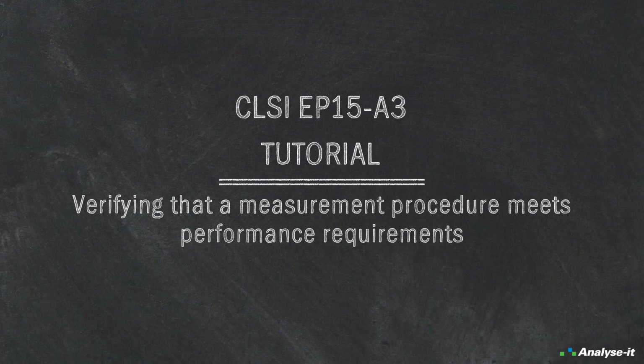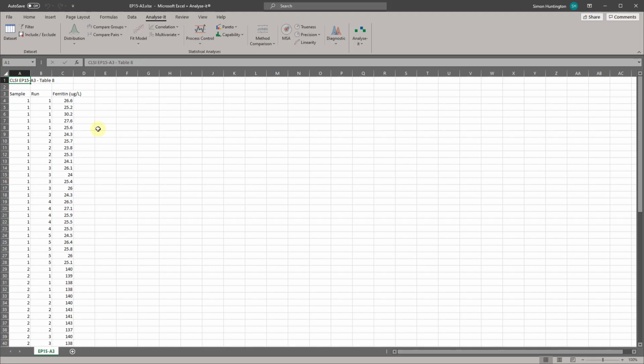This tutorial follows the CLSI EP15-A3 protocol to verify the precision against the manufacturer's claim and estimate the bias using proficiency testing materials. The EP15-A3 example worksheet shows three columns. The sample column identifies the concentration or level of analyte in each sample. Run identifies the day number of each run. Ferritin identifies the measured value for three replicates of sample in each run. We recommend you use the example worksheets included with Analyse-it as templates for your own analysis.